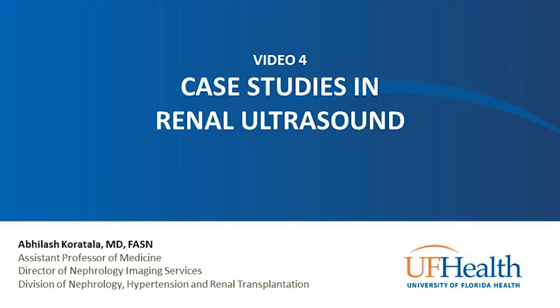In this image-based presentation, I'm going to discuss some of the interesting renal ultrasound cases that we encountered in our practice. When you're doing a quick bedside renal ultrasonography, especially in a patient with acute kidney injury, it's very easy to mislabel any anechoic structure that you see in the renal pelvis area as hydronephrosis. Today, I'll go over such traps, including some of the normal anatomic variants that can mimic hydronephrosis.